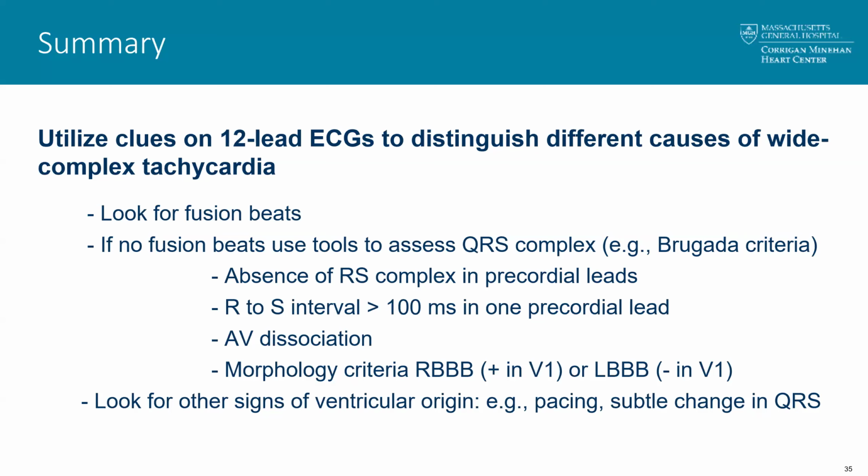Today is really just about a basic guide to patient evaluation and ECG evaluation, trying to make the diagnosis. So this is really about diagnostics more than anything else. But regarding ablation, versus medical therapy, some general things you can think about: you can take a look at the patient's structural substrate and assess whether you've got any evidence of structural abnormalities, potentially in the area where your ventricular arrhythmia could be coming from.